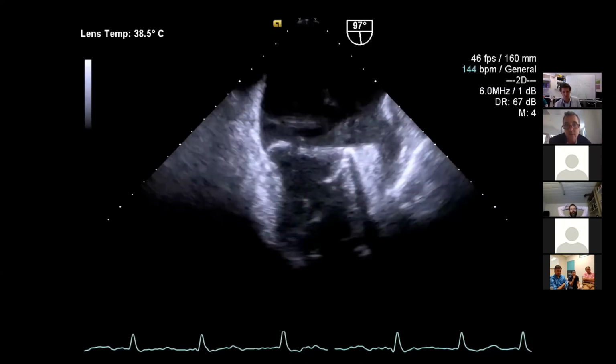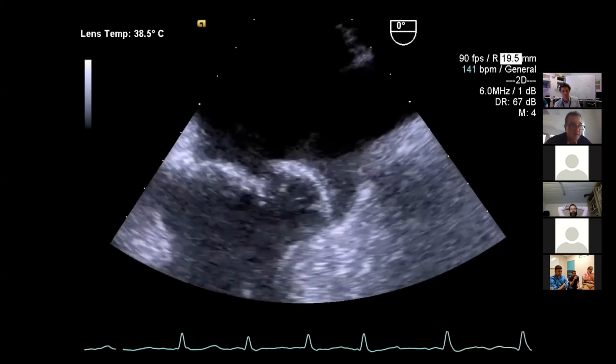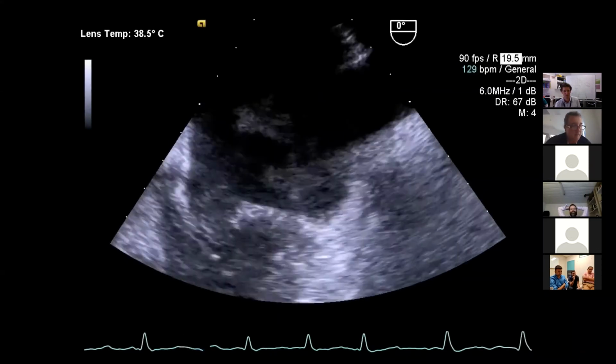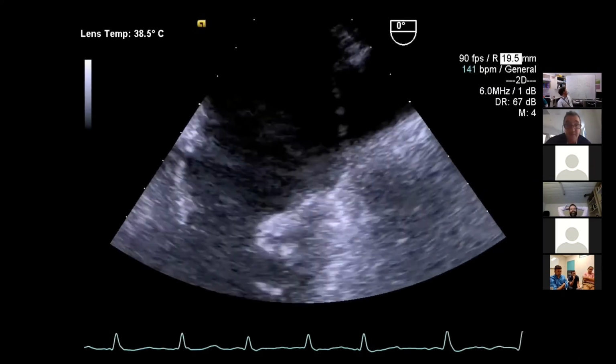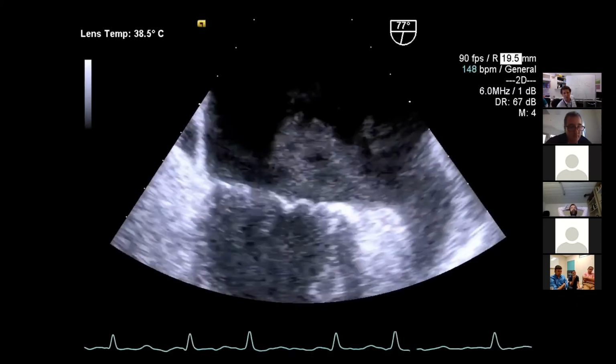I'm sorry, Con, to pick on you if you're not doing a lot of TOE. All right. Yeah. And here we come round into our, sorry, that's still 0.